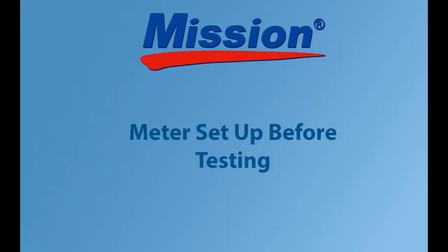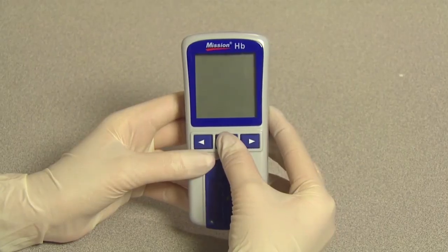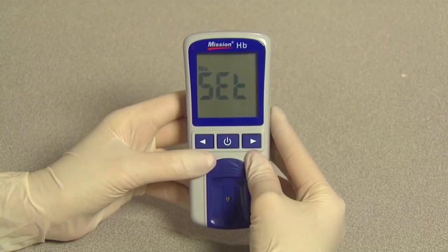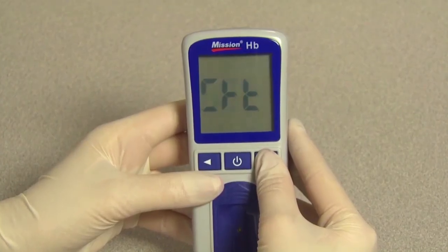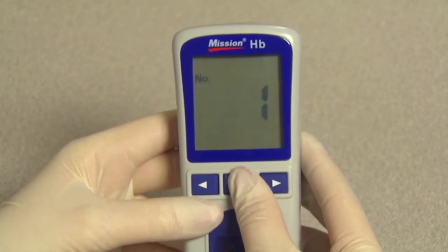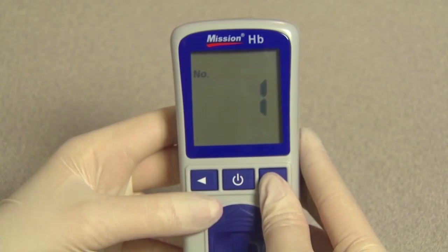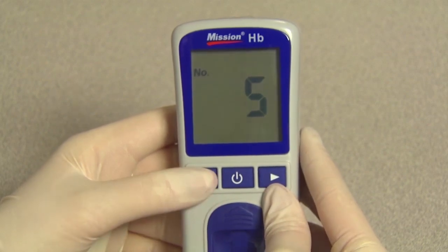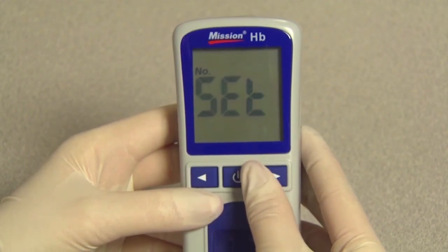Meter setup before testing. To begin initial setup, press and hold the power button for four seconds after inserting the code chip to enter the meter setup mode. The test number setup screen will appear first. You can navigate between the different setup sub-modes by pressing right or left. Press the power button to select the test number setup if needed. You can set the test number from 1 to 999 by pressing right or left until the desired number is displayed. Press the power button to save and return to the meter setup screen.